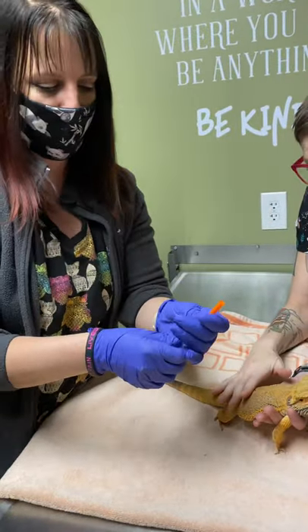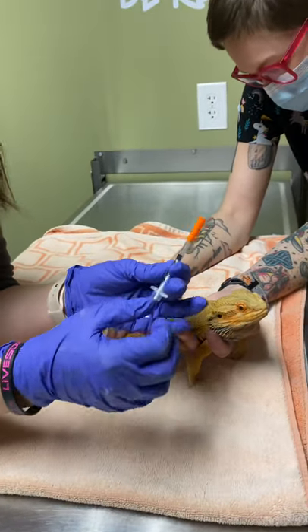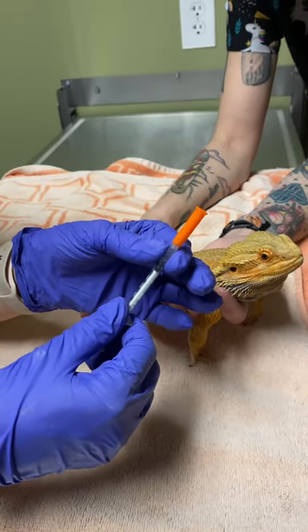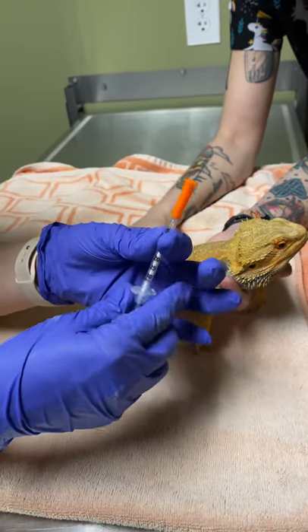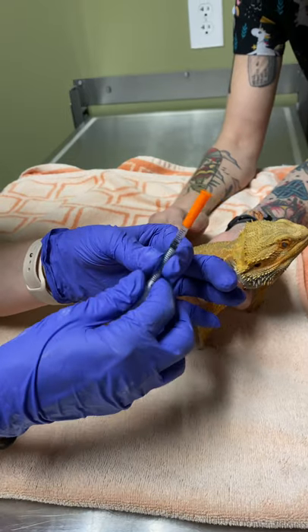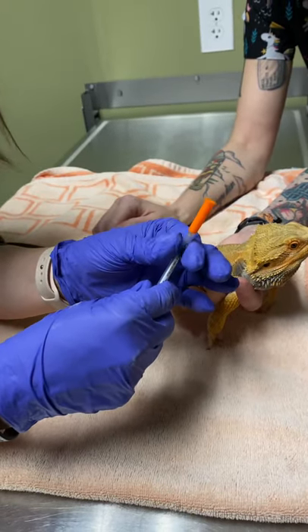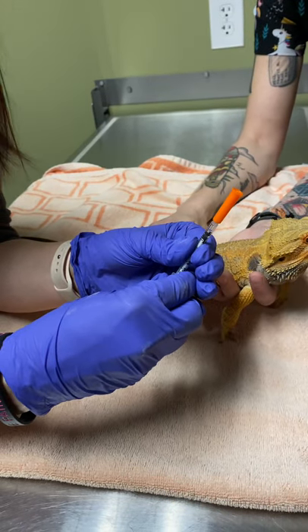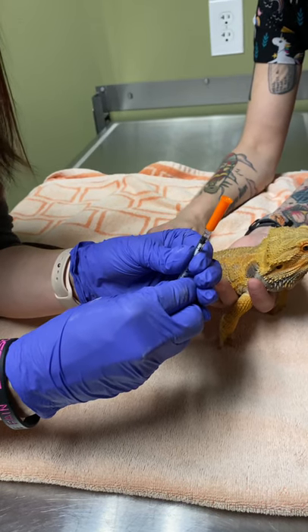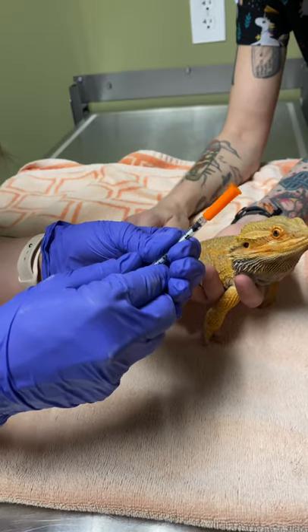If that's the case, you want to make sure you get it out and thaw it completely. When it's in the freezer, we pull them back because the liquid will expand. You're going to want to thaw it and go back and forth and up and down to make sure there are no ice chips and it's completely thawed. Then depending on the size of your bearded dragon, we will have a specific amount in the syringe already, gauged just for your pet.